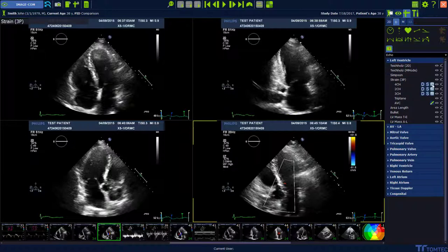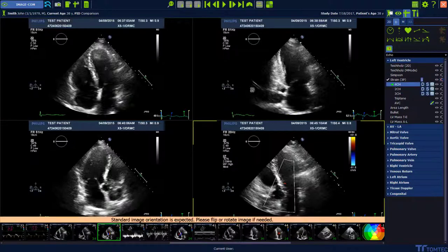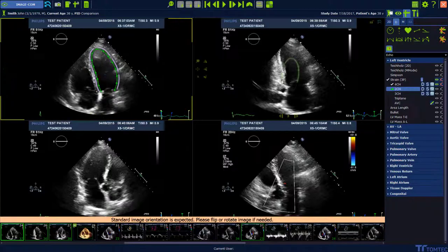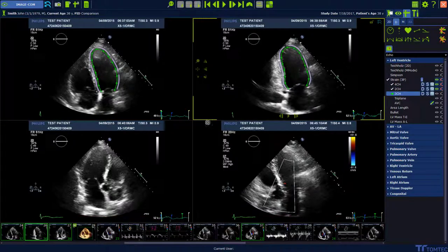Press the automatic detection button to start the analysis. Tell the software where to find the four-chamber view, the two-chamber view, and the three-chamber view.